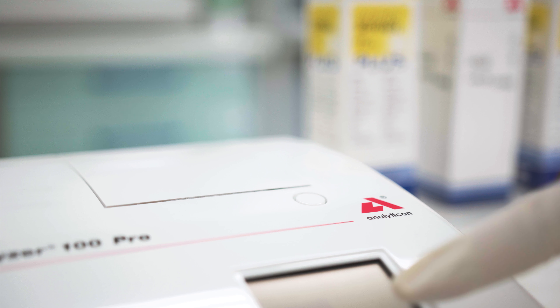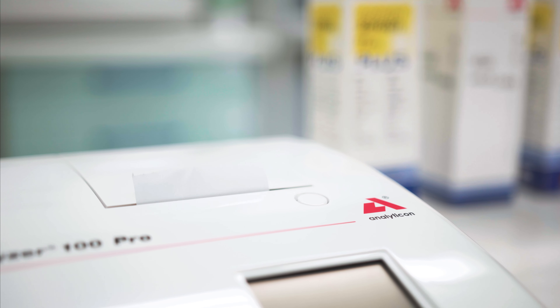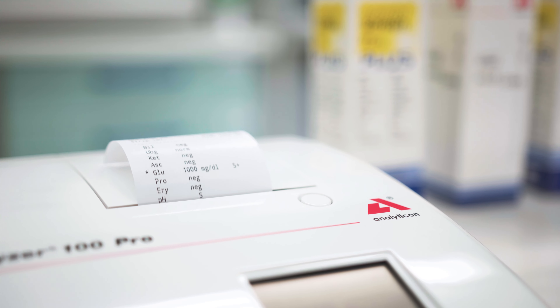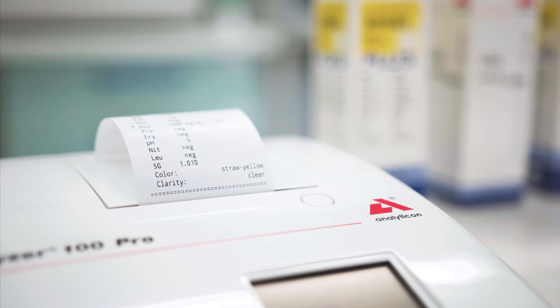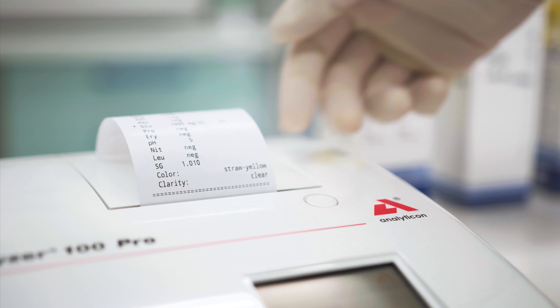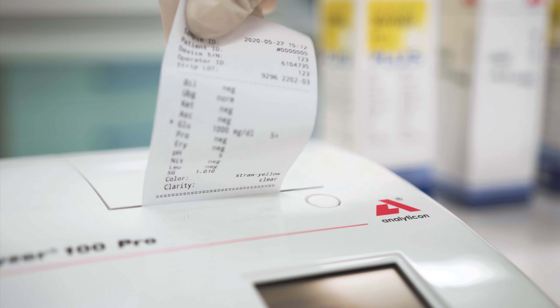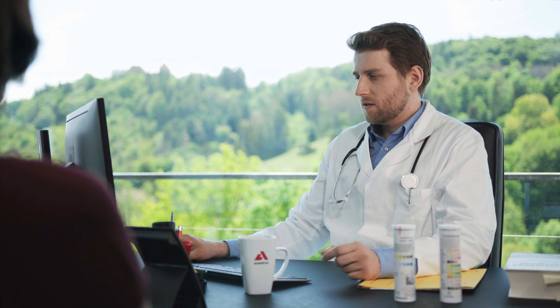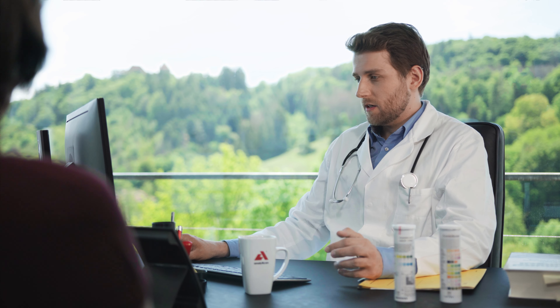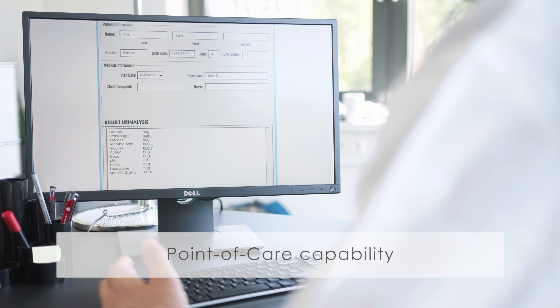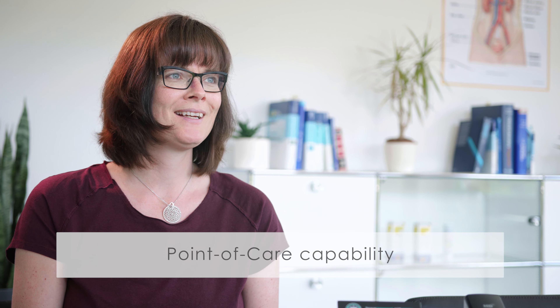Suspicious results are clearly visualized on the display and printout. Due to its unique connectivity capabilities, results including patient data can automatically be transferred to a middleware or directly to the laboratory information system.